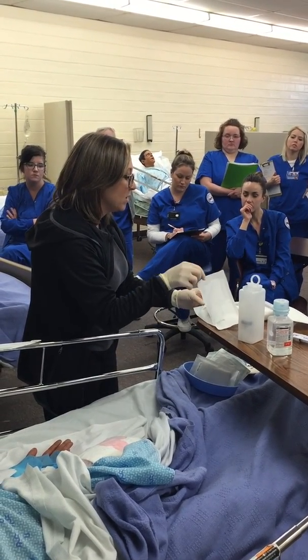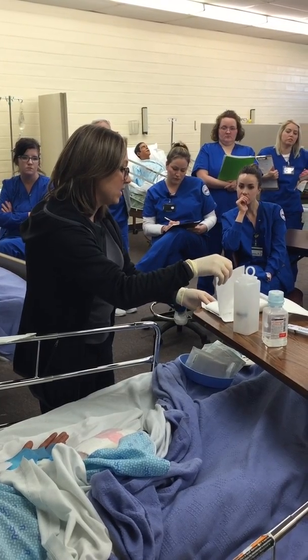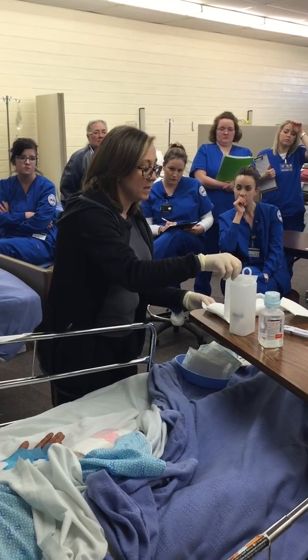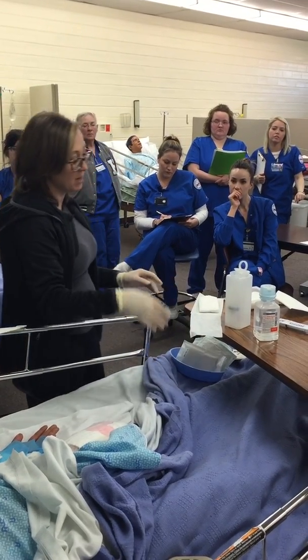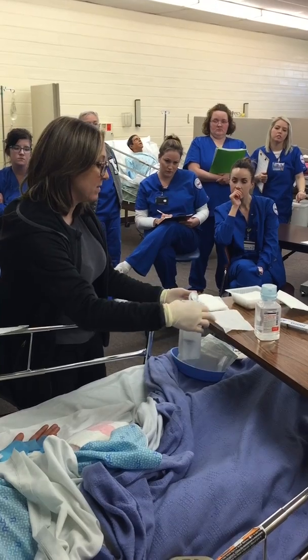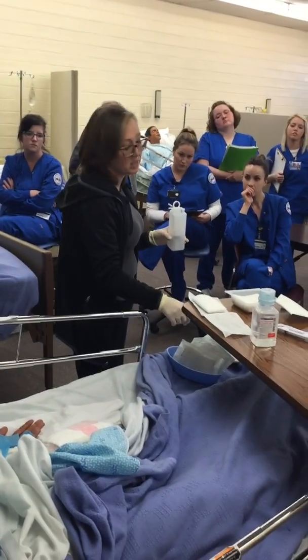So it's opening out, and then I just set it over wherever I need it. Okay, so you need to keep it on your sterile setting there, and that's dry. I just kind of move this over out of the way, and then move that over. And if you want, because I'm a ripper, I don't like to leave everything, I push that back or however I'm going to do that, but I'm going to leave that on there, okay? So that's really all I'm going to use for my dressing change.